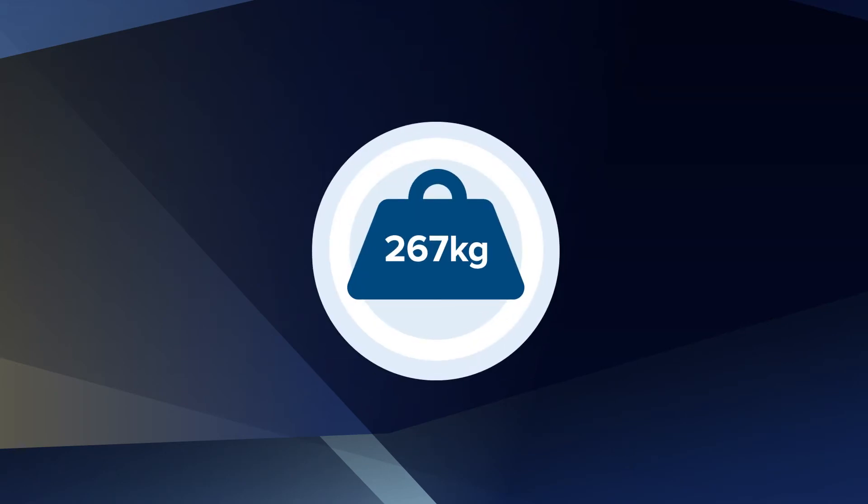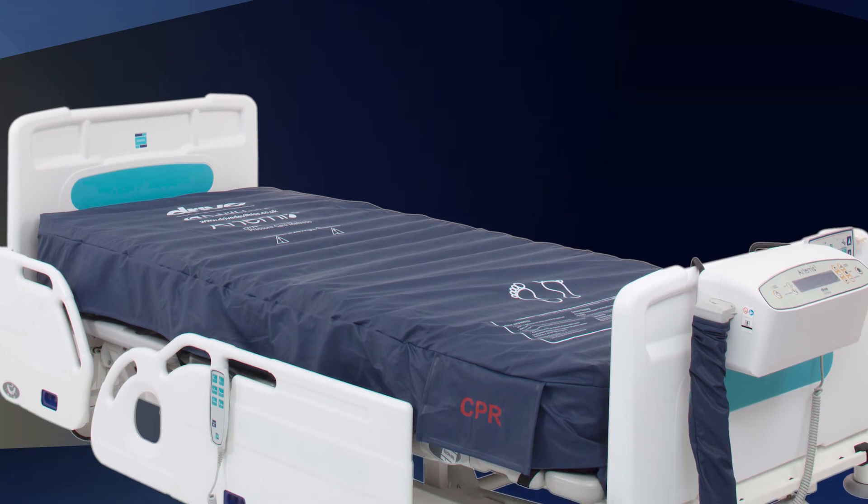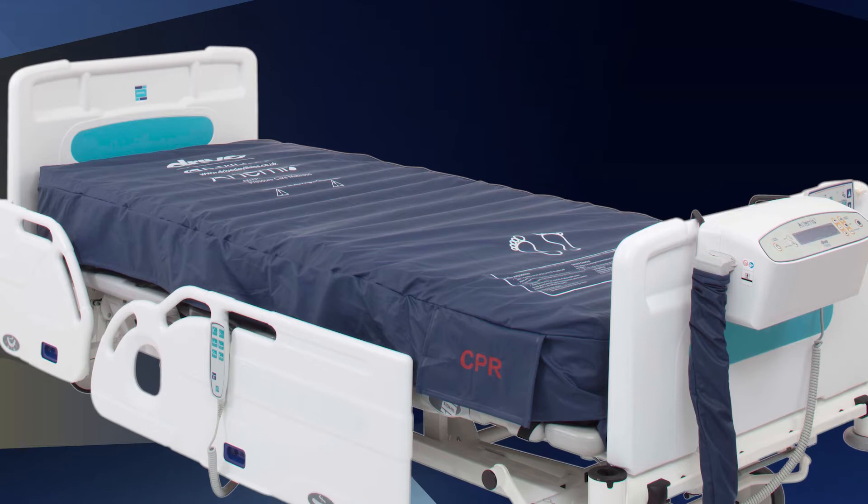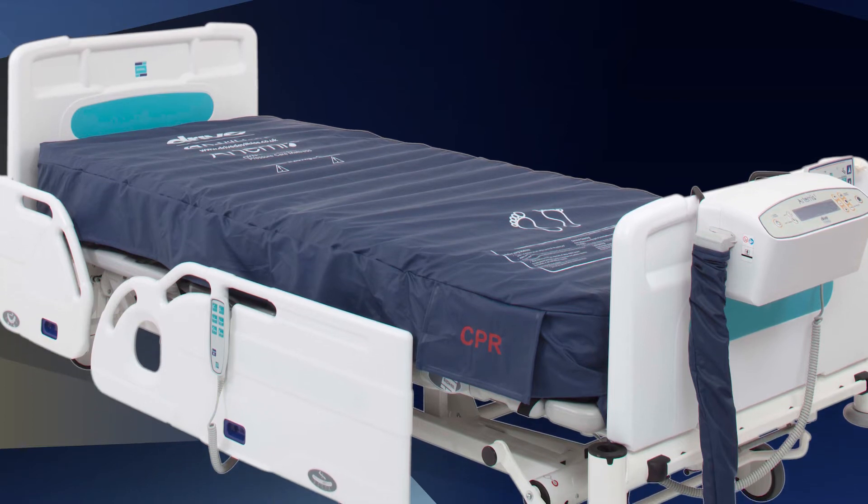The maximum patient weight is 42 stone or 267kg, including any bedding or accessories. The mattress is for very high risk patients, including up to a Category 4 pressure ulcer; however, frequent monitoring and repositioning are required.